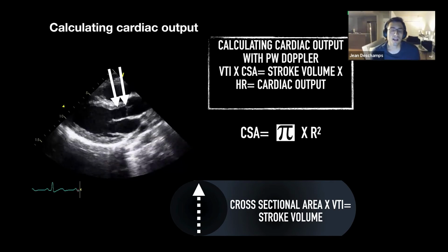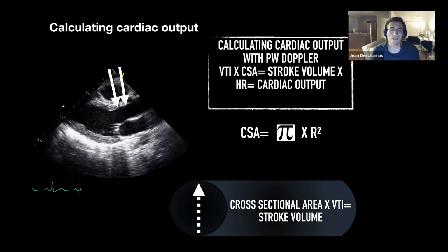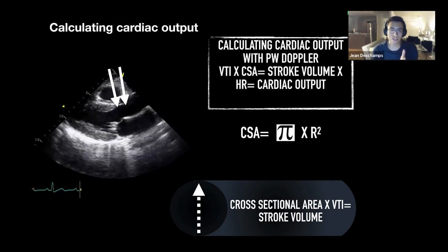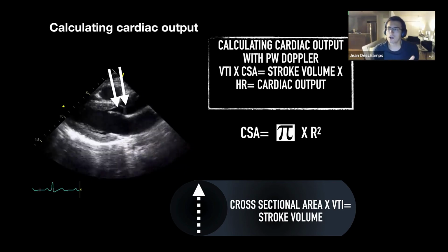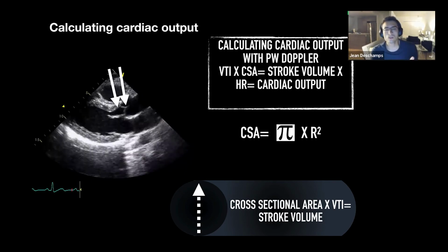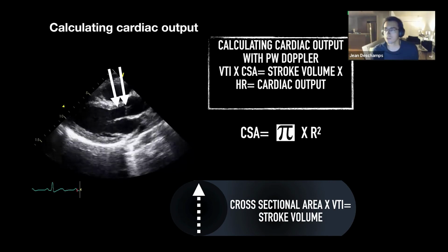No, absolutely. And I think you're right. In reality, on a day-to-day basis, I can't say I always measure it, because I'm not looking for an extremely precise cardiac output. I'm looking at, is it really high or is it really low, right? And so that measurement, we know for a number of reasons, is already inaccurate.